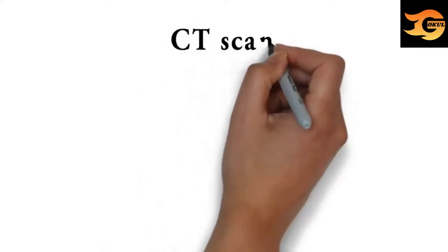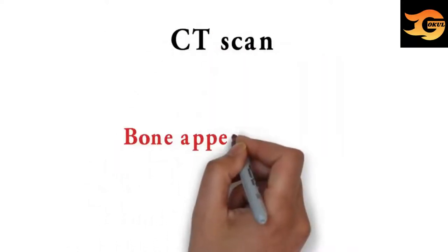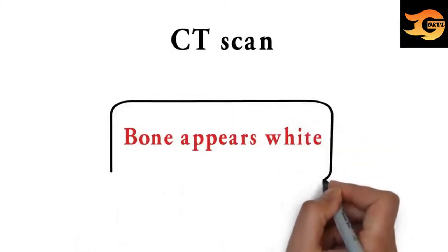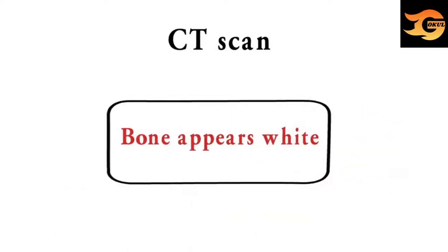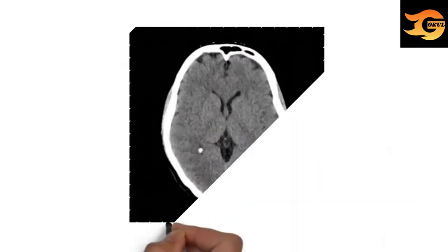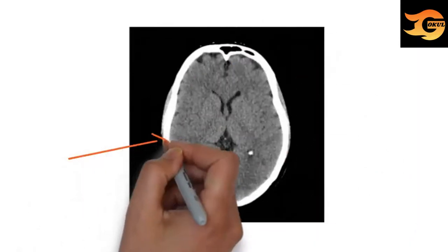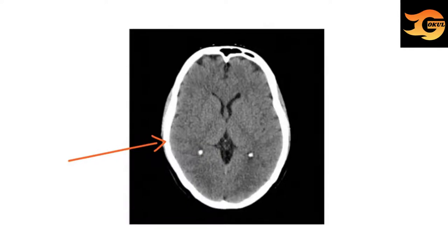First of all, CT scan. In CT scan, bone appears white, and that's the main differentiating point from MRI. This is the CT scan of brain. You can identify it as a CT scan because the skull bone is appearing white.